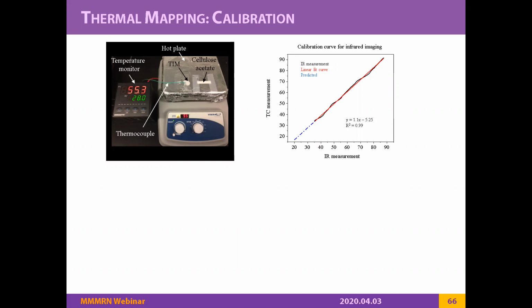While saying that, we tried our best to maintain the same setup that we used for the calibration system, because even if we change the illumination slightly, it will impact the results greatly, right? So you have to take the results with a grain of salt, because we were not super sensitive about keeping the illumination consistent, but we tried our best.